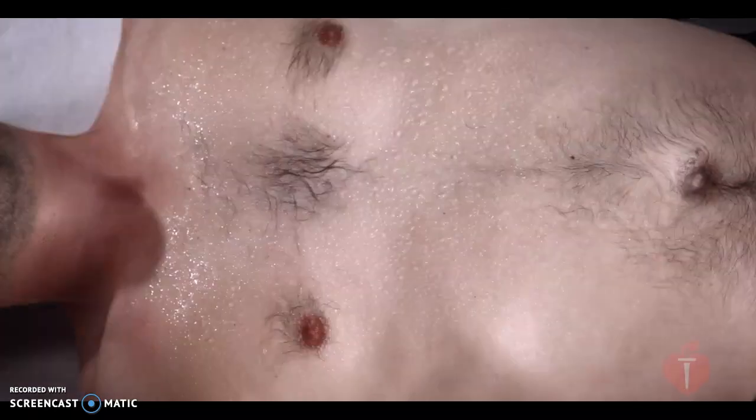Water on a victim's chest can also be a problem. It could allow the shock to travel through the water between the pads, ultimately preventing delivery of an effective shock dose to the victim's heart. If someone is lying in water, you should quickly move the victim to a dry area. However, if the victim is lying on snow or in a small puddle, you may use the AED.